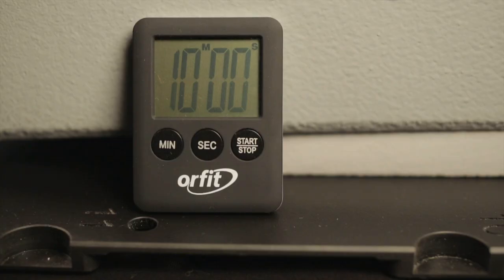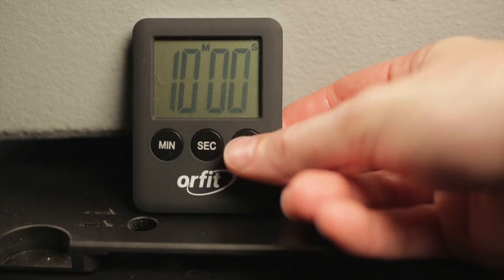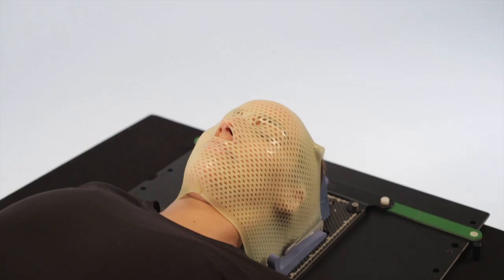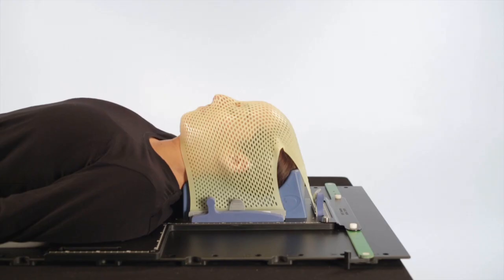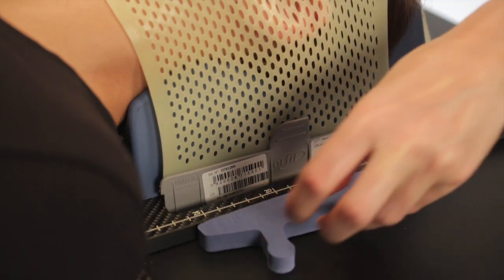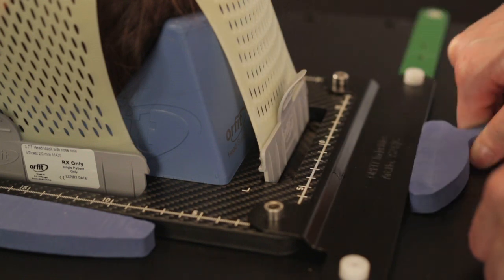Leave the mask to cool on the patient for at least 10 minutes, during which the mask will slightly change color. After 10 minutes, the mask may be removed. Gently remove the profiles and lift the mask from the patient.